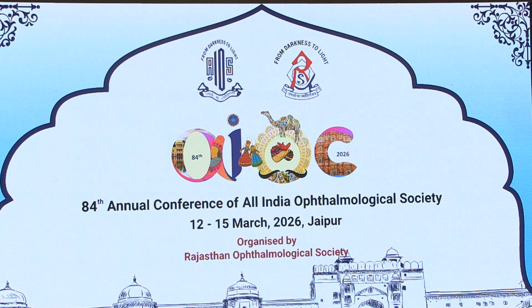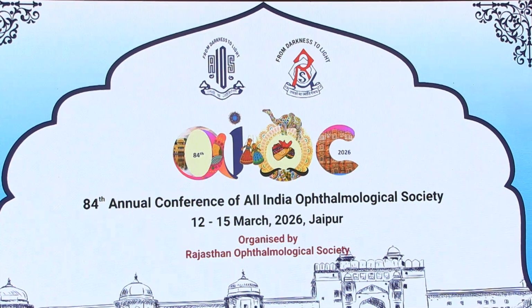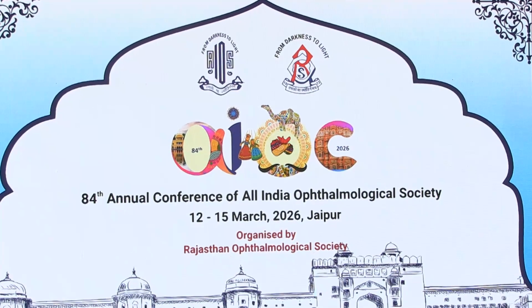Thank you, Dr. Anil Kothari, for that excellent wound construction in MSICS. What is most important in wound construction, which is the art and soul of SICS surgery, is that the depth of the incision should be uniform throughout. We would like to take one or two lines from our expert panel on MSICS wound construction. Dr. Kimea.